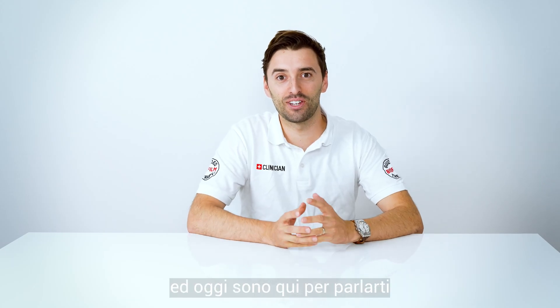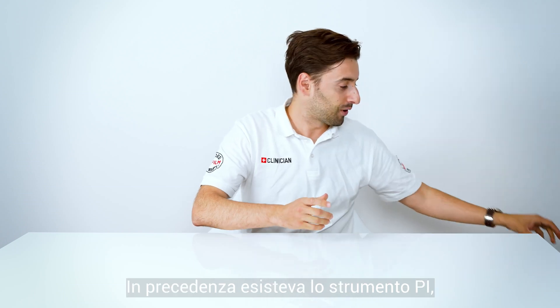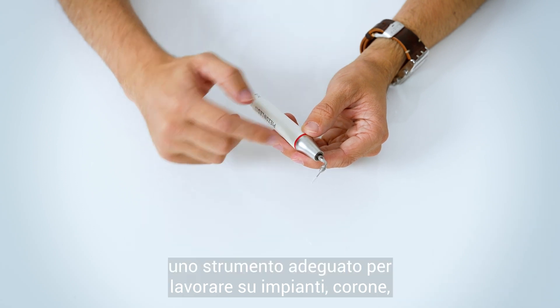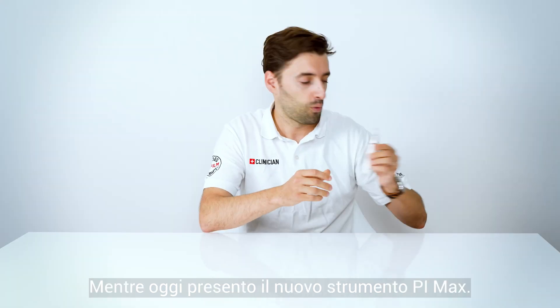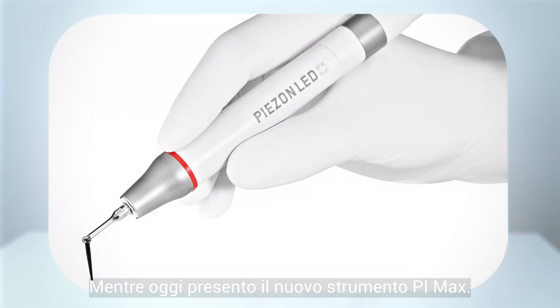Hi guys, I'm Celso de Costa and I'm here today to talk about an excellent new product. As you know, we had our PI instrument — that stands for peri-implant instrument — a PIC instrument to work around implants, crowns, veneers, restorations, and even orthodontic appliances. And today we are changing it for the newest PI: the PI Max.